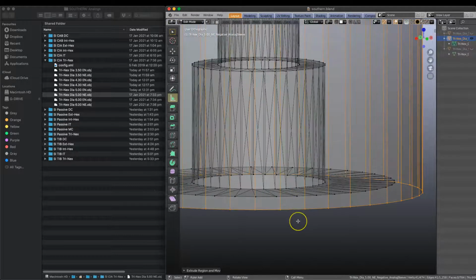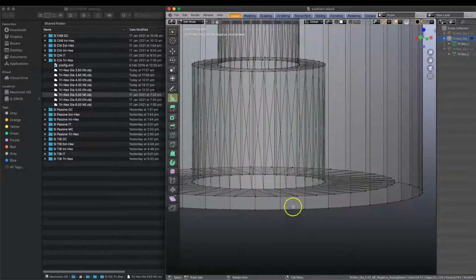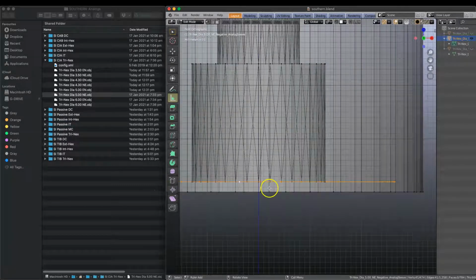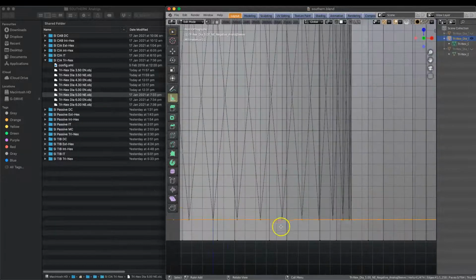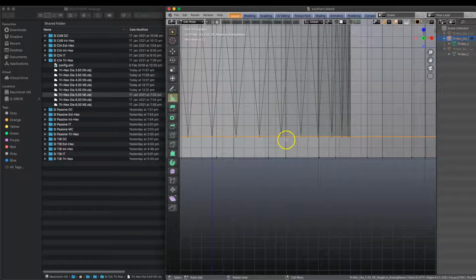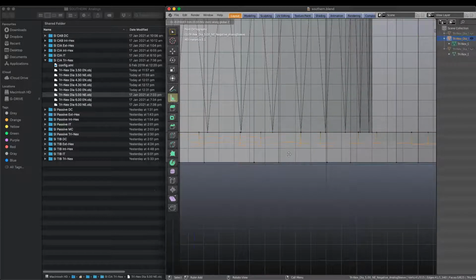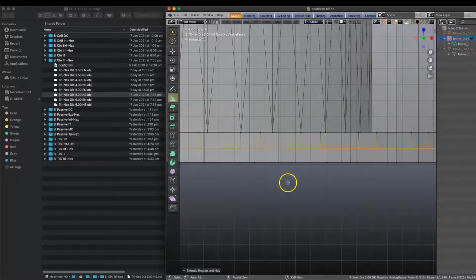So I'm going to deselect this edge loop, so I'm going to left click on the 3D space. I'm going to select the inner one here, Alt left click, and now we have to view it again from the front. Make sure you are viewing exactly from the Y plane inward, so away from you. So we can zoom in here. I'm going to extrude that down by 0.1 millimeter. So E and Z, pull it down to this block here on the grid. Set it down, left click.